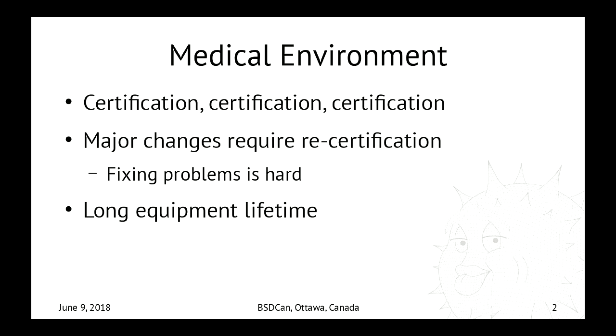Another problem there is the long equipment lifetime. It's nothing like the life cycle we are used to from IT equipment. An X-ray machine being installed today is probably going to be there for 30, 40, 50 years. Of course, it'll see updates and changes, but it's not the 3 to 5 years that we are usually dealing with in IT.